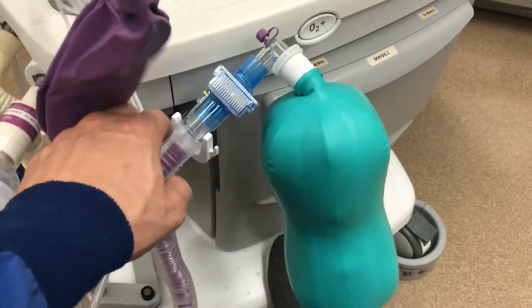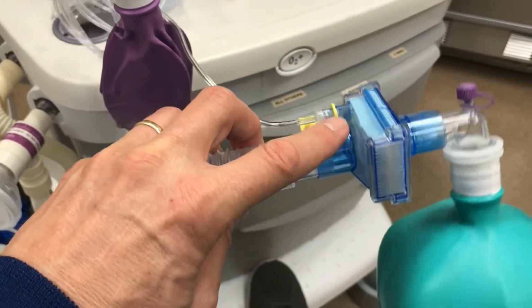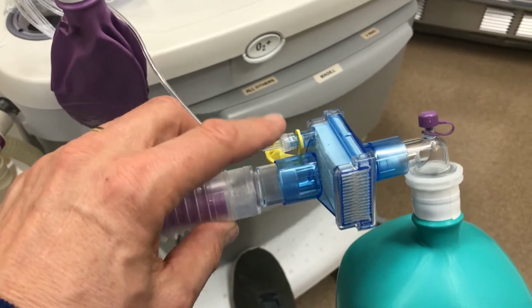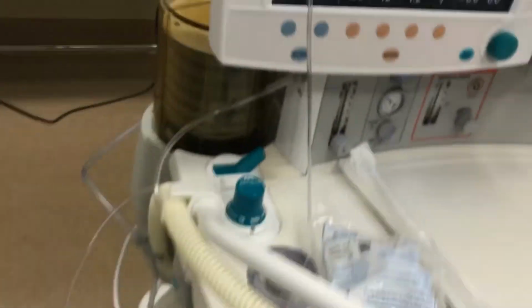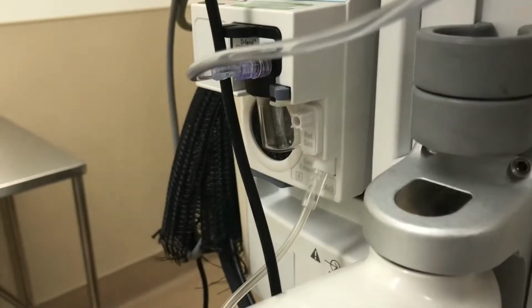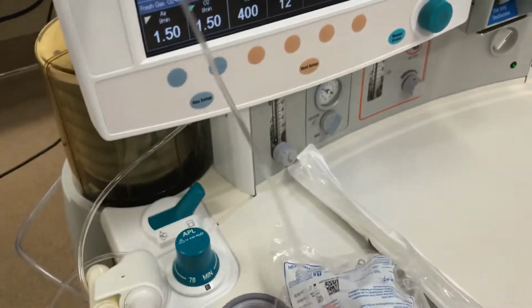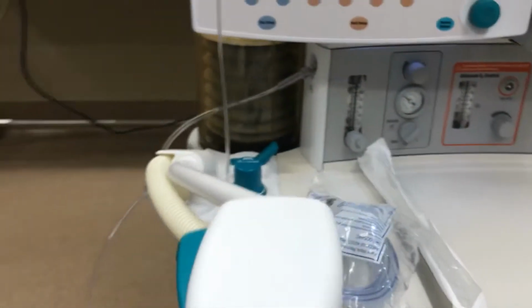But in order to help keep our system clean, we will go ahead and use one of the blue HME filters, which also have 99.999% efficiency, and then we will put our gas sampling line behind it. That will help keep moisture out of our gas sampling line, but we do have a moisture trap back here also if that's necessary. Keeping this behind the filter will allow us to exhaust that to room air if need be.